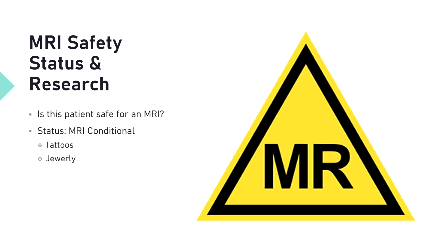Based on these findings, the patient status is MRI conditional. This means that the scan can only proceed if specific safety parameters are met. My research on MRIsafety.com confirms that tattoos, particularly those with iron oxide pigments, require monitoring for thermal injury. Furthermore, all body jewelry must be removed or verified as non-ferrous to prevent movement or burns.